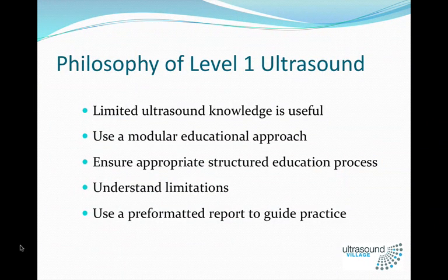The philosophy of level 1 ultrasound is, firstly, we feel that limited ultrasound knowledge is useful. We also think that a modular educational approach is very effective, as long as you ensure that there are appropriate structured educational processes in place. It's really important that people doing ultrasound understand their limitations. And one of the ways we do this is to use a pre-formatted report, which we've designed and we'll go through in a minute.